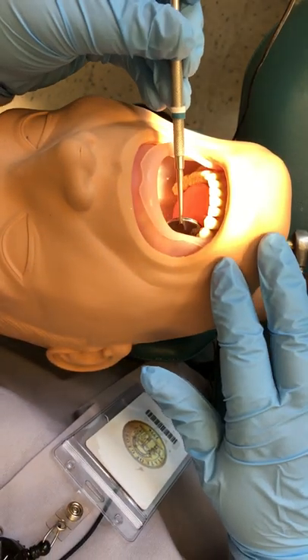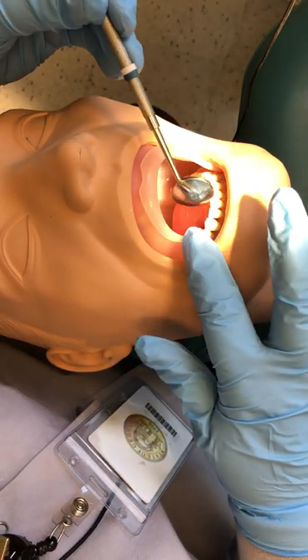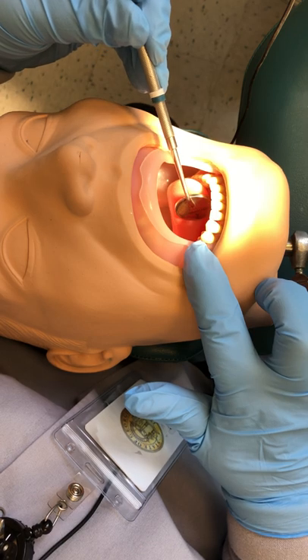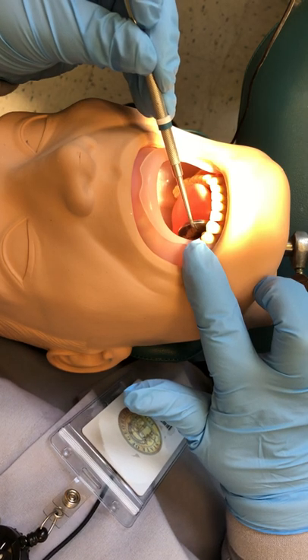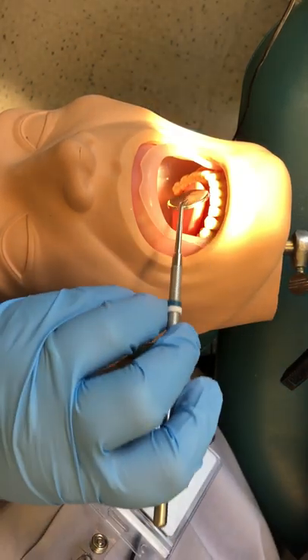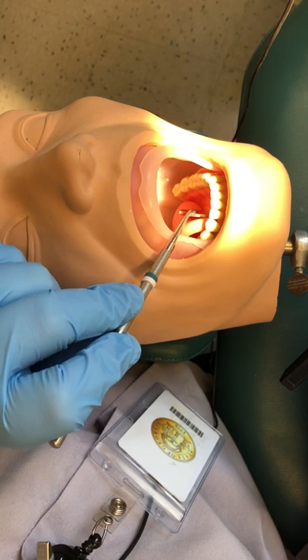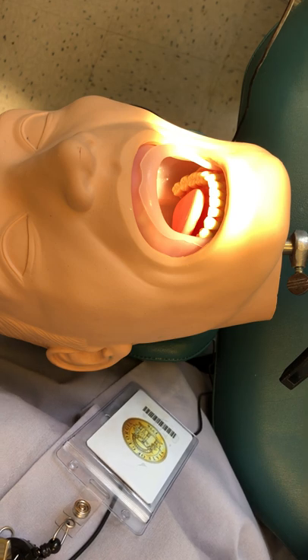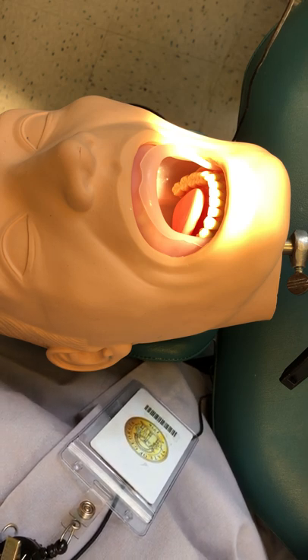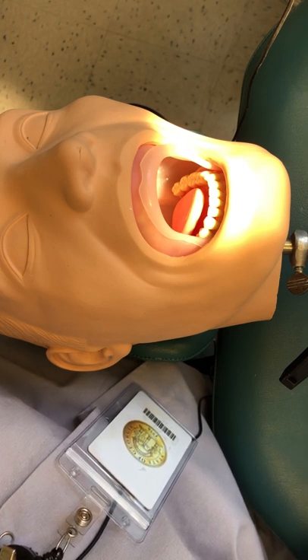You could also use the mirror to retract the tongue. When retracting the tongue, don't just push down on the tongue — that could elicit a gag reflex on your patient. We want to tuck the mirror between the tongue and the alveolar ridge and then pull the tongue to the side, away from the lower right teeth. You can also pull it the opposite direction — tuck it between the tongue and the alveolar bone and pull it towards you. This moves the soft tissue out of the way so we can see more easily. It also serves as protection: when we're running the hand pieces or using sharp instruments, we don't want to pierce or cut our patient. So retraction and protection is another primary use for the mirror.